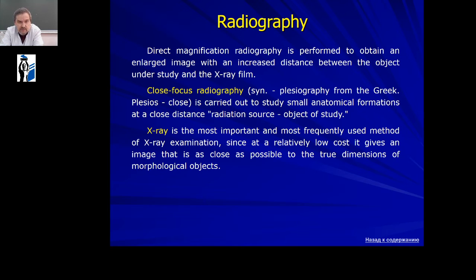X-ray is the most important and most frequently used method of X-ray examination. At a relatively low cost, it gives an image that is as close as possible to the true dimensions of morphological objects.